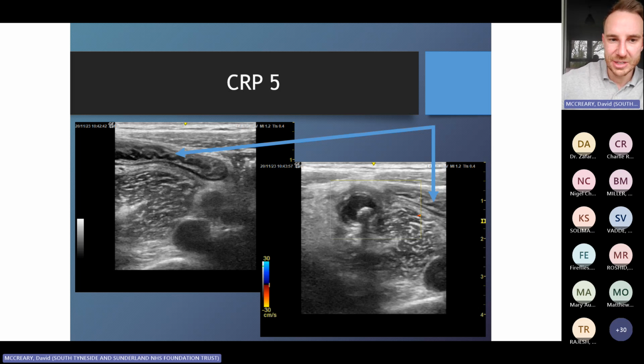However, if we look at this loop above, this is the bit I mentioned to you about an appendix being pre or post ileal. So this is definitely terminal ileum. I know it looks blind-ended on this picture, but if you watch really closely, just at the end of the clip, you can see this starts to merge with probably another loop and doesn't look as blind-ending. And in fact, this was the appendix, and this was this same loop above. Does that make sense to everybody? So I think this loop and this loop are the same thing and will be terminal ileum.